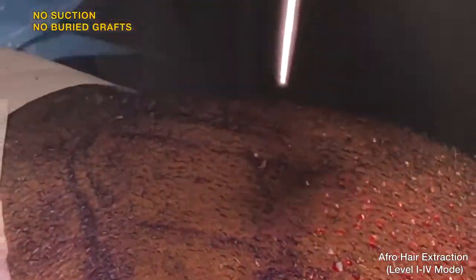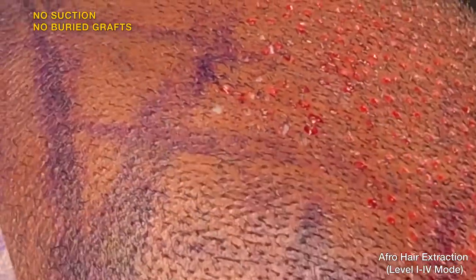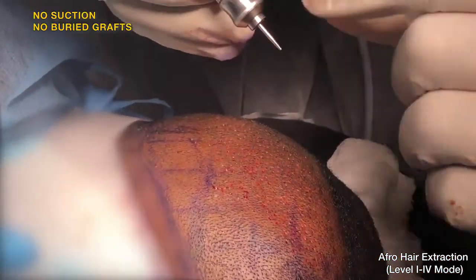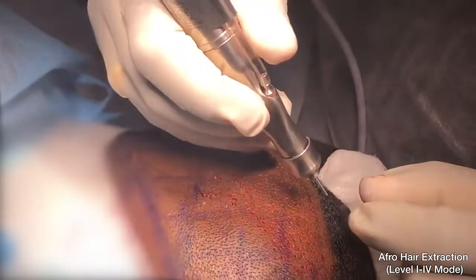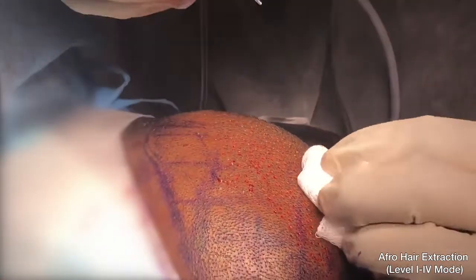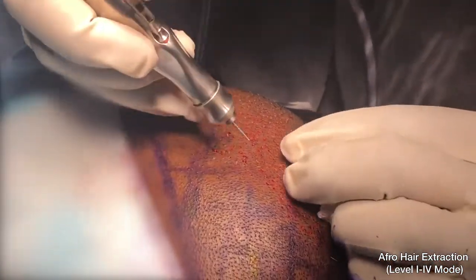This device has no suction feature. There is no suction device attached to it that is trying to suck the life out of the graft. The pulling effect is entirely the result of the punch's intelligent design. It pulls the graft and guides itself through the course of the curvature of the hair. Coupled to the Dr. U Graft Nurture handpiece, it stops itself at the correct depth, doing this all by itself without transecting the follicle.